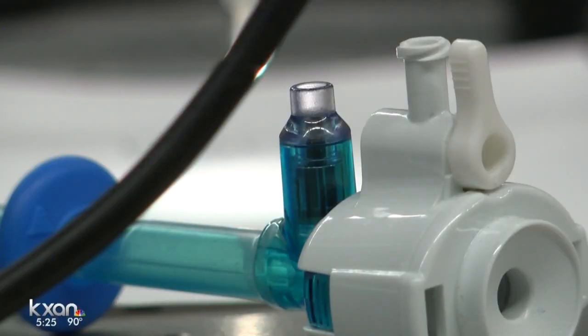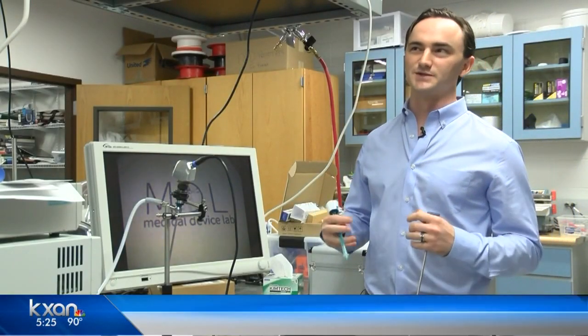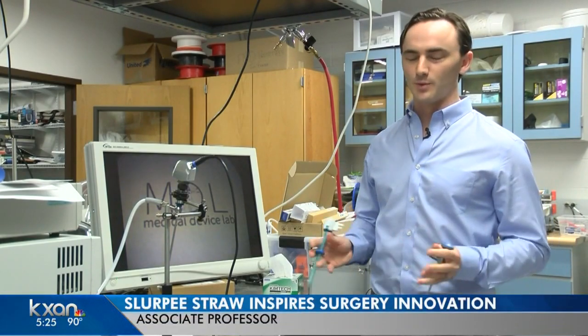During a minimally invasive surgery, the surgeon will make incisions on the abdomen and place a trocar port inside those incisions. What this allows for is basically the surgery doesn't have to open up the body.